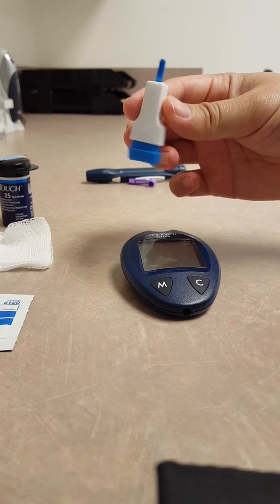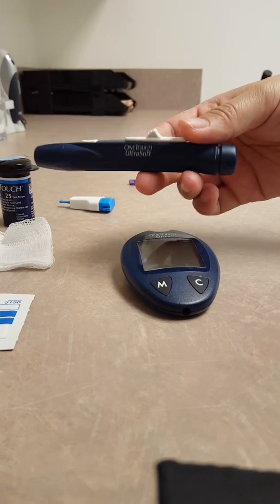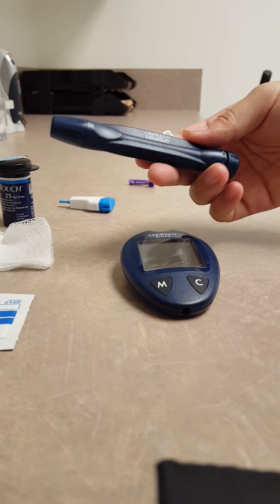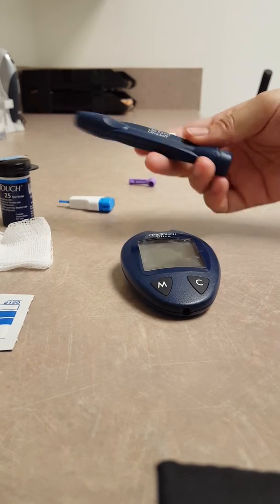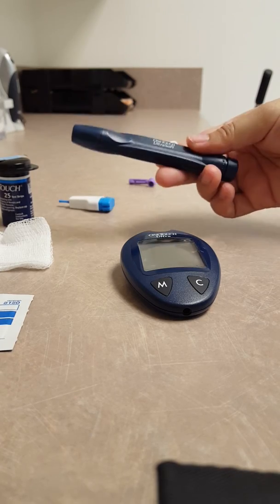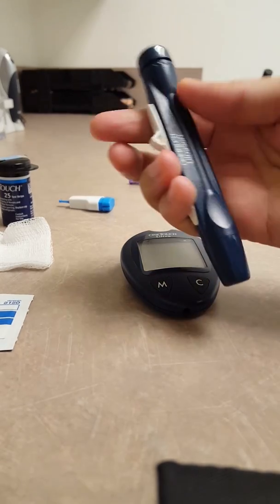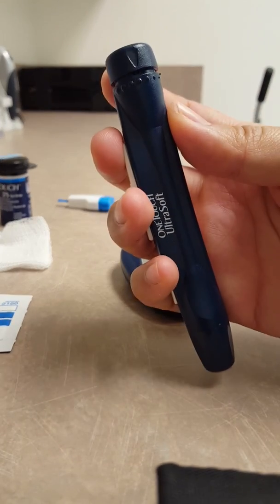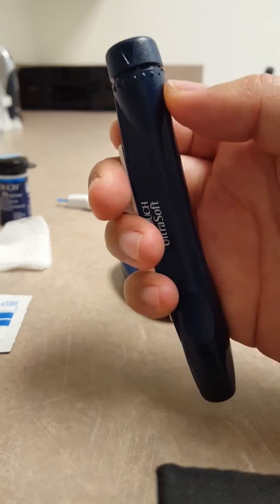And then you'll need a lancet. This is a one-time single-use lancet, and if you are using the injector pen you might have something like this or something similar. So let's set up the lancet device first in case you don't know how to set this up. On one side you should have a dial that will show you either a number or some dots like this.